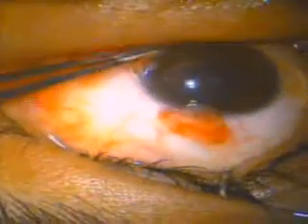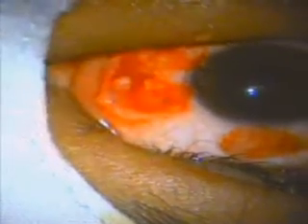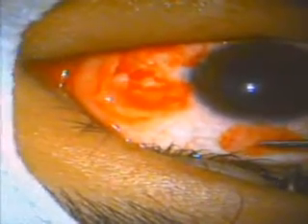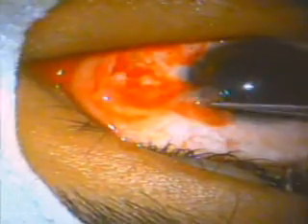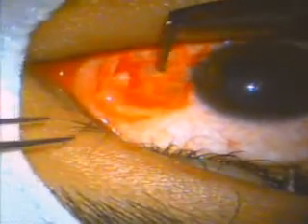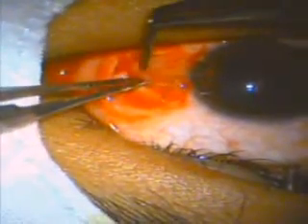The head of the pterygium is excised using avulsion technique with Colibri's forceps and any remnant tissue removed with Tuck's corneal knife. The body of the pterygium and subconjunctival tissue is dissected, excised. At this stage, graft is moved to the bare scleral bed.